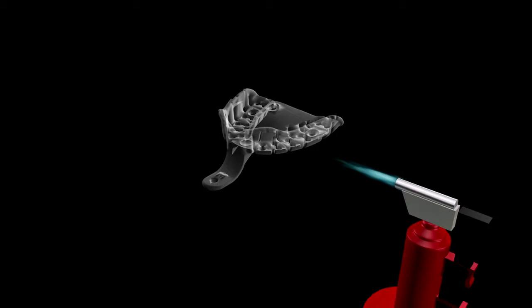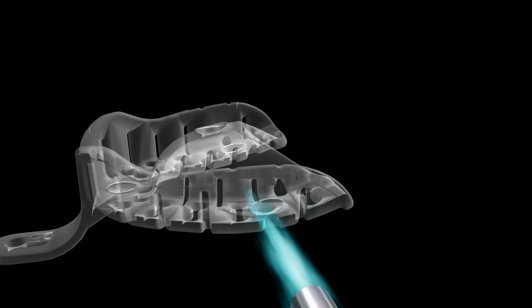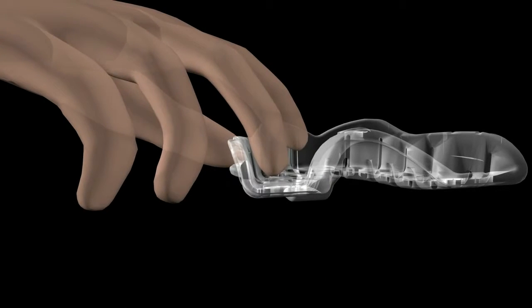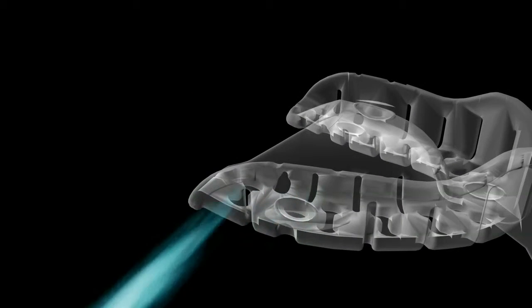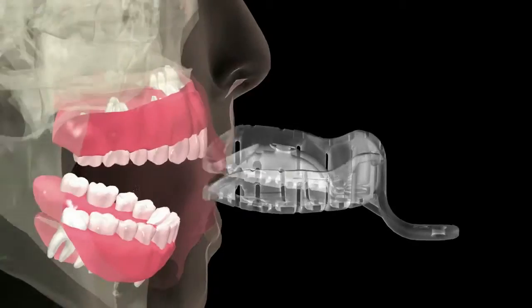If the operator deems it necessary, small modifications can be made outside of the mouth in some cases by carefully flaming specific areas of the tray to further shape, and then chilling the tray in cold water to re-harden. Care must be taken not to overheat the tray, and to not return the tray to the patient's mouth until it has been completely chilled.